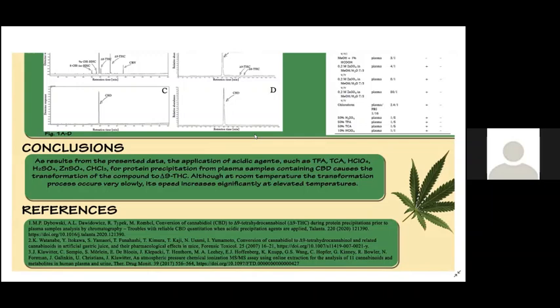The presented information is only a fragment of the entirety of research described in the article, conversion of cannabidiol to delta-9-tetrahydrocannabinol during protein precipitation prior to plasma samples analysis by chromatography: troubles with reliable CBD quantitation when acidic precipitation agents are applied, in the Talenta journal.